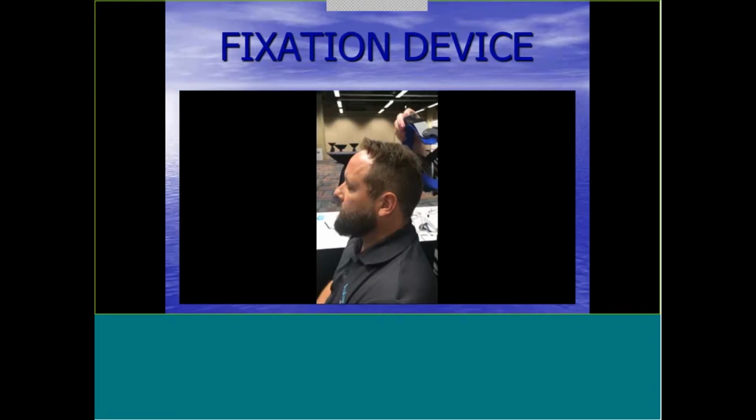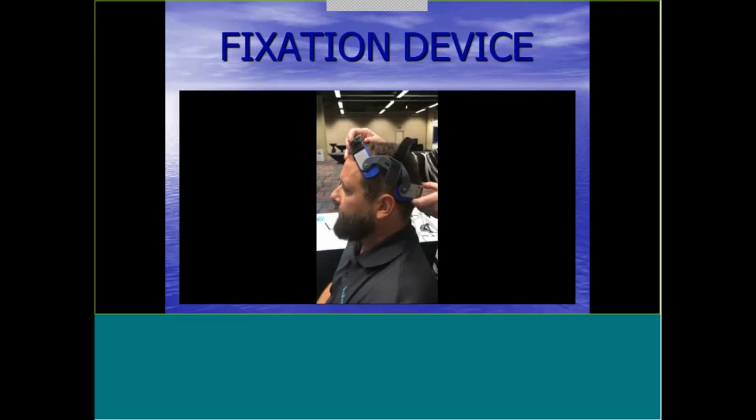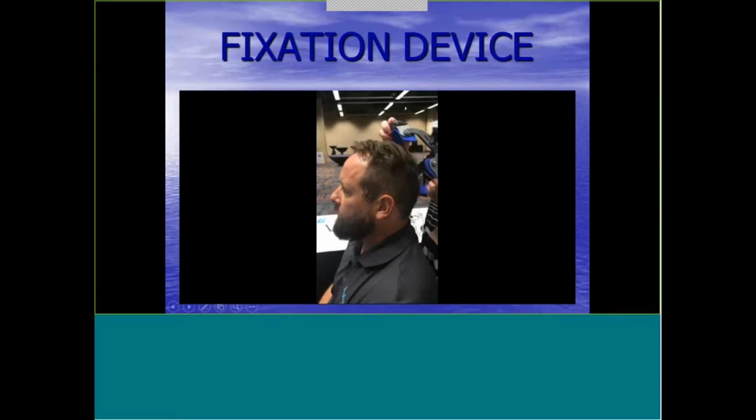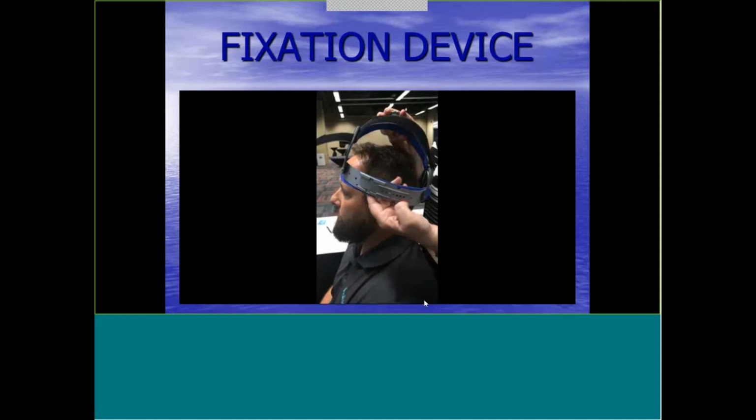First thing, I wanted to make sure that I hope you can all hear it. I'm applying the headgear first, making sure that this goes below the occiput, and then this lines up with his nose. Okay, now I'm going to tighten this.